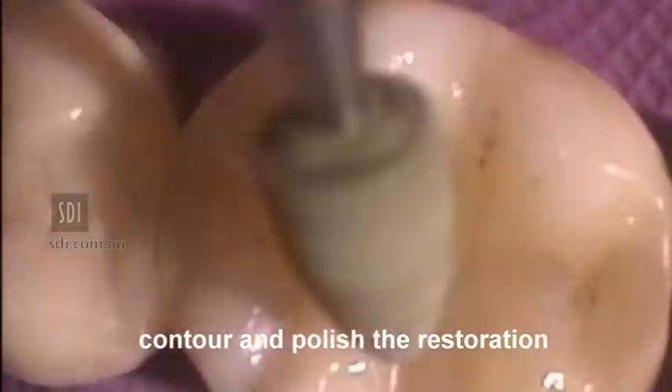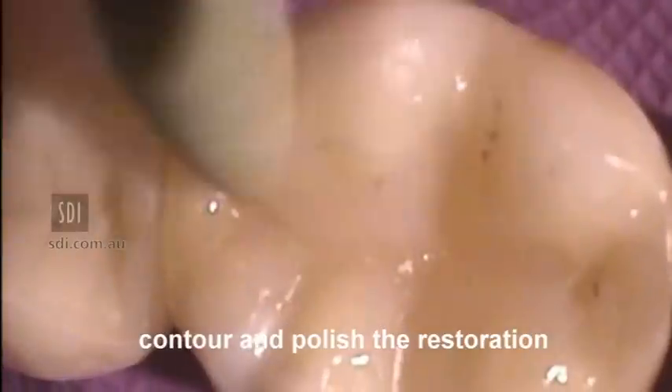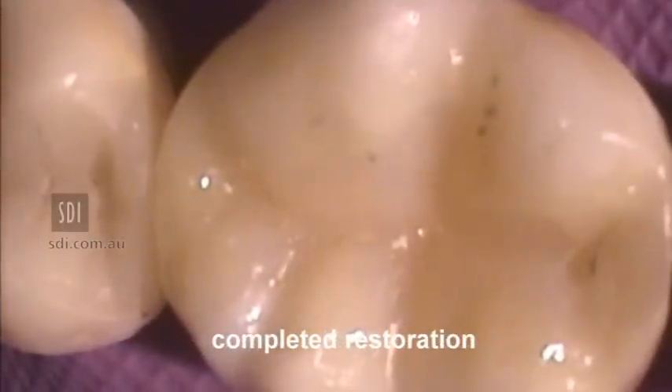Contour and polish the restoration with suitable rotary instruments. Completed restoration prior to occlusal adjustment.